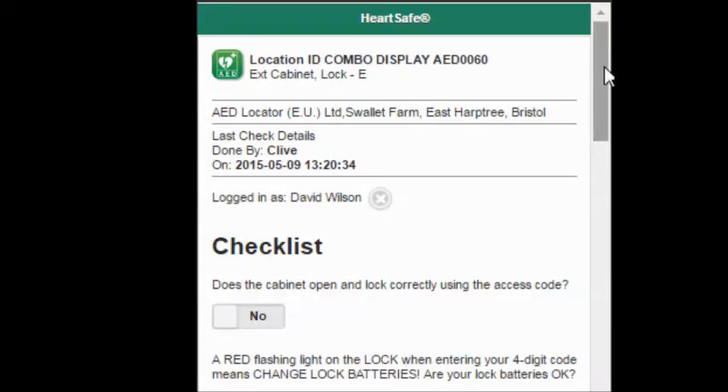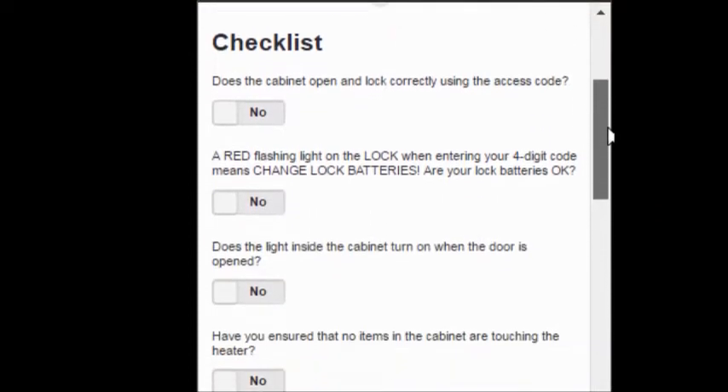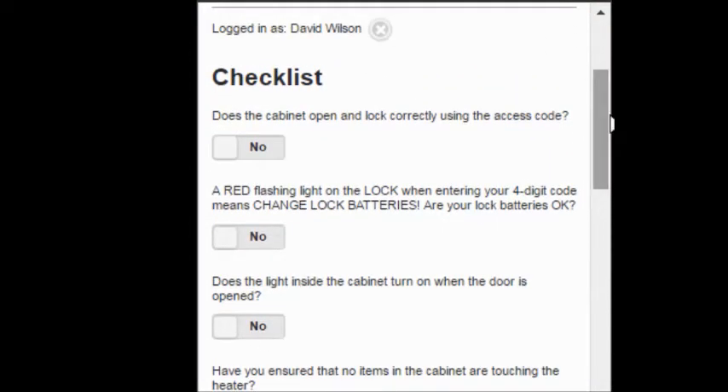Once you've entered and saved your login details, you're presented with a checklist. All you need to do is work through the series of questions and answer them yes or no by sliding the toggle from one side to the other. As we've entered the cabinet and we know that the lock works correctly using the access code, we can slide the first question to yes.